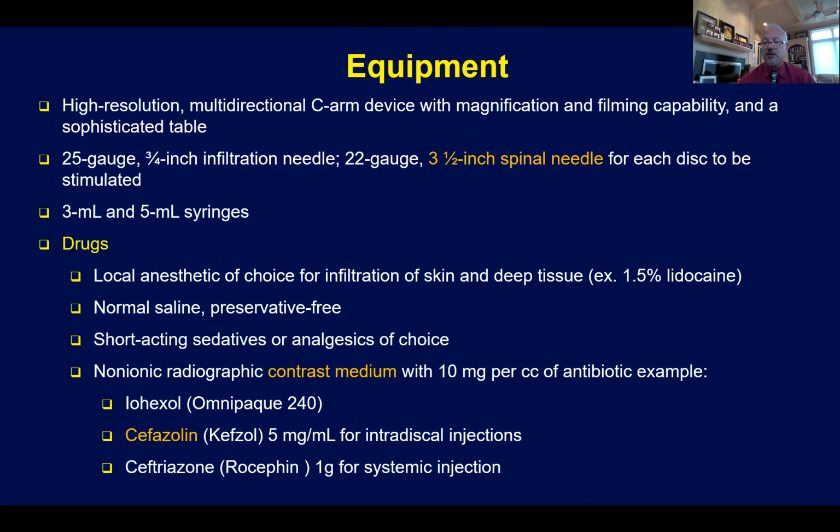These are the contraindications. The equipment is well known to us. There are some authorities who might recommend the use of an ultrasound for the performance of discography in the neck.